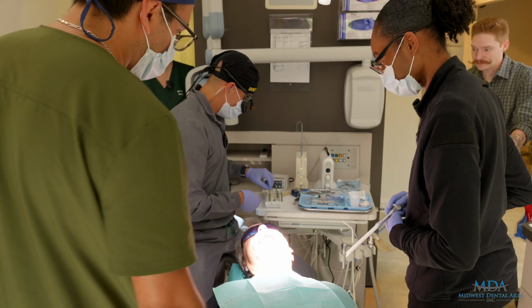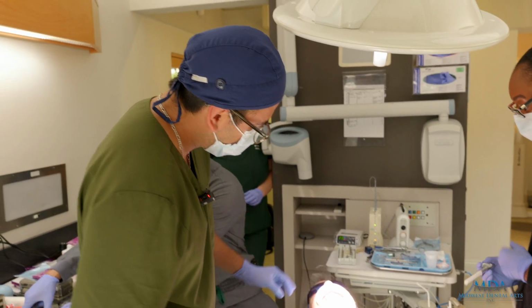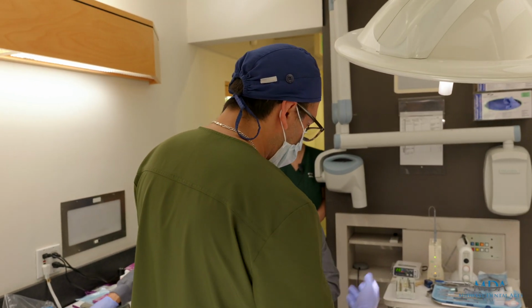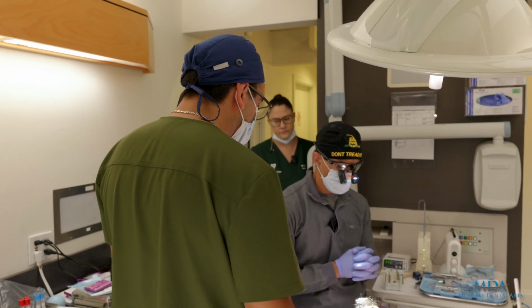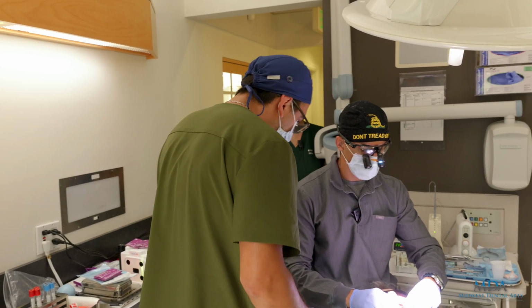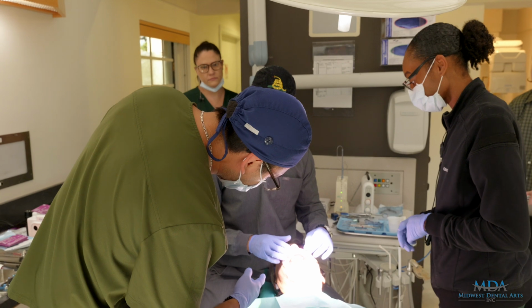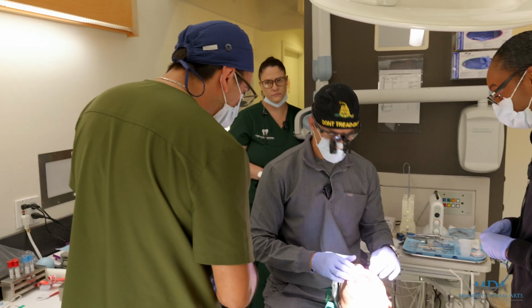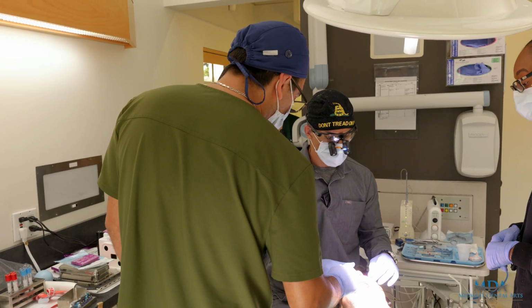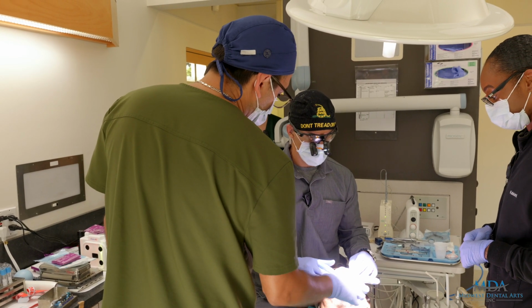Cool. So now we have final torqued all the upper multi-unit abutments. They're really nice and tight. None of them had any type of mobility, right? Because that means they're all nice and strong and healthy. So what we can do, Doc, let's do the iCam really quick. And then we'll place the multi-unit healing caps, the covers I mean, on top of these, and then we'll continue on the bottom.